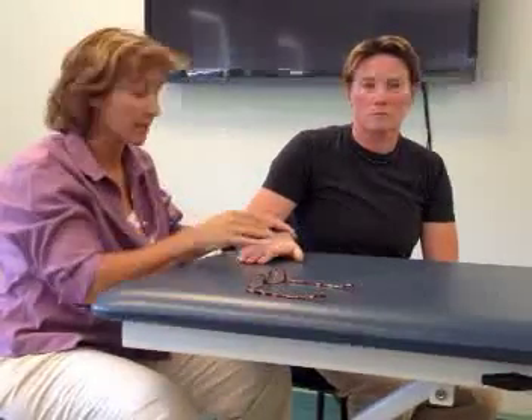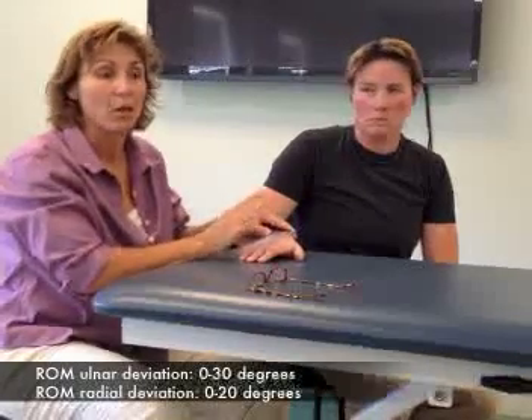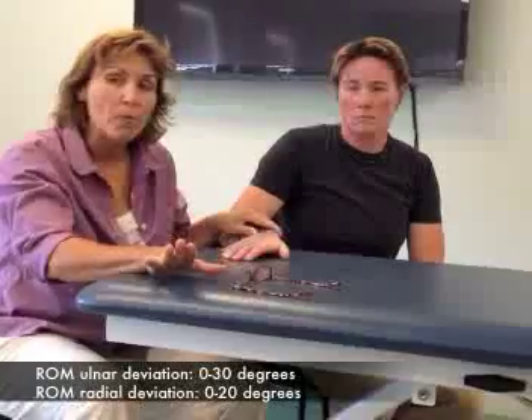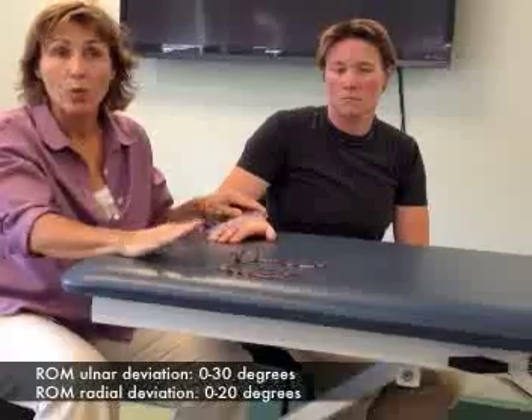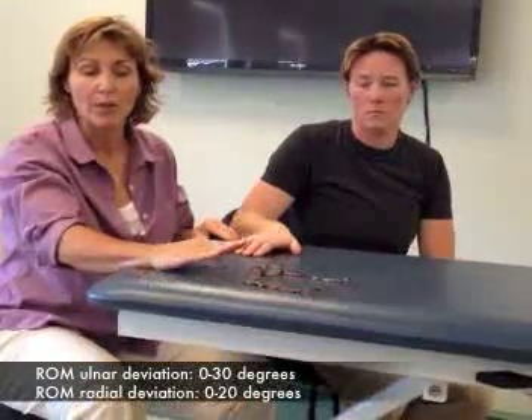Sometimes when you do this, you have to kind of sneak your fulcrum up a little bit. As long as you keep your moving arm and your stationary arm in line, it's okay if your axis moves a little bit. Your norm for ulnar deviation is 30 degrees, and for radial deviation it's 20 degrees. You always have a little more ulnar than radial.